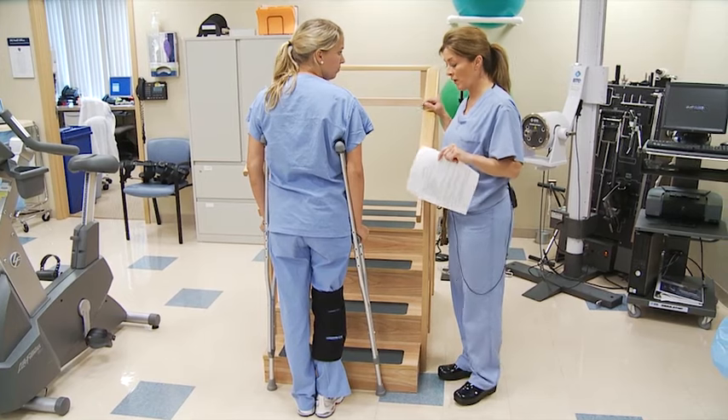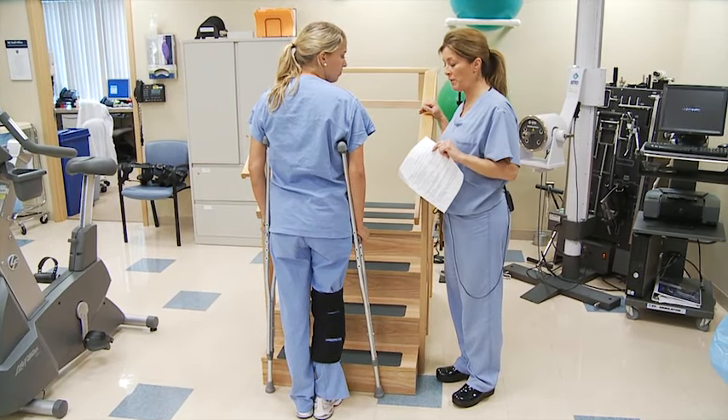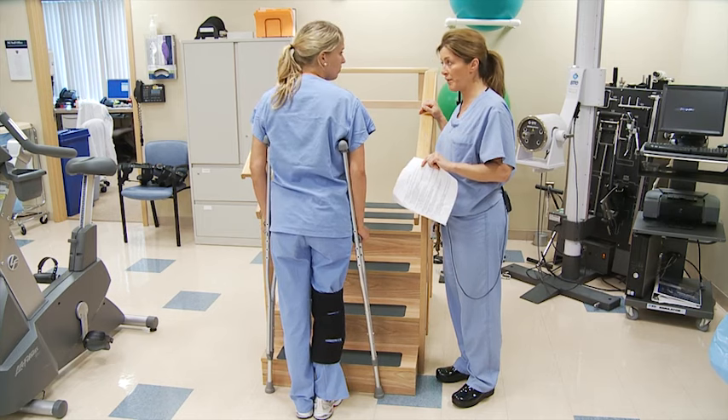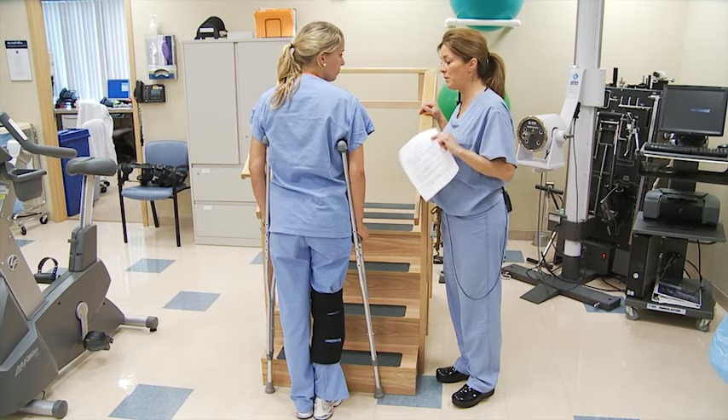You're going to do uninvolved limb — being the left limb — up first. Then bring the involved limb, bearing only the amount of weight you're prescribed, and then meeting with the crutches.